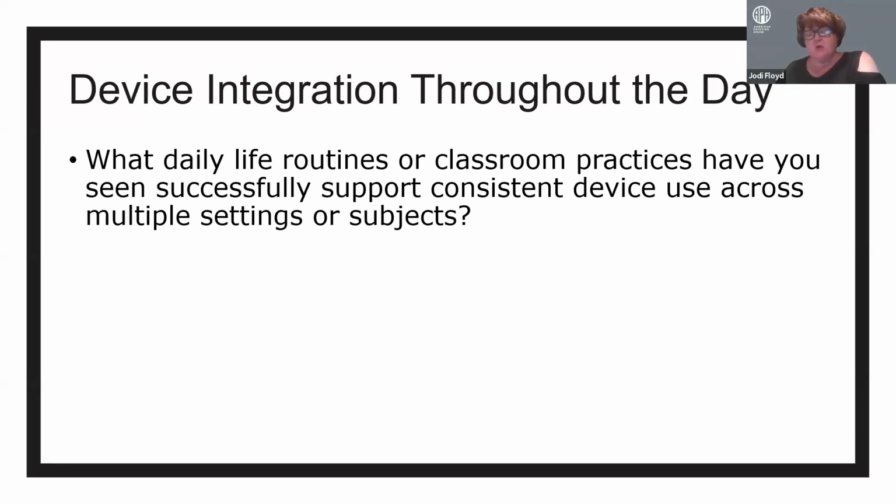So one of the things that comes to mind, or a particular student for sure, we talked about using the device outside of school and incorporating it into those ECC skills and into daily life. So we walked outside one day and we were looking at finding the pole to then go up to see the street sign. And my student instead found the power line pole and traced up it. And as she moved her monocular across, there were birds on the power line. And she was astonished that birds sat on power lines. She had never before seen that.